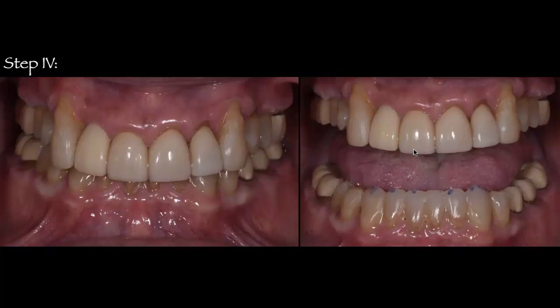Now, of course, you don't want to do this on a patient that has any periodontal compromise of any of the maxillary teeth. These teeth are very nice and stable. They were nice and stable at the beginning of treatment. They're still nice and stable now. We did have some periodontal issues, bone loss and hypermobility on these premolars, and that's the reason why those were extracted, and implants are going to replace those once we are finished with this case, which we are not. But I want you to know that that's something that you need to keep in mind.